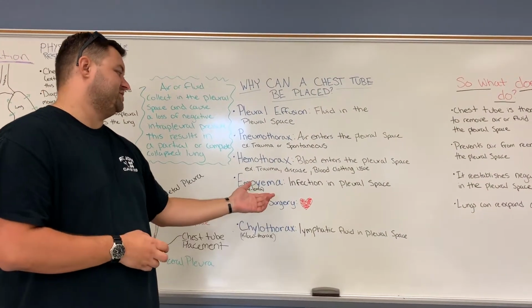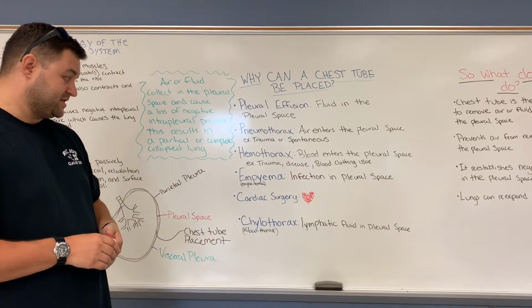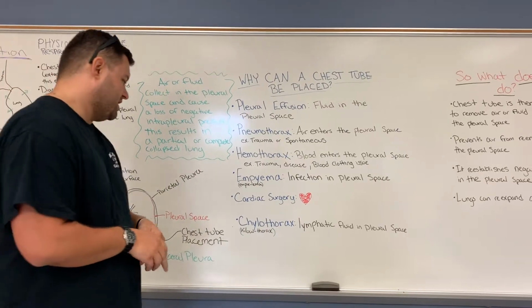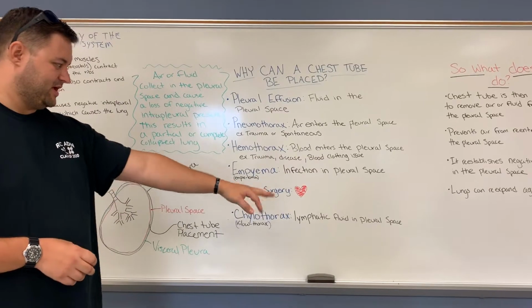Empyema, an infection in the pleural space. Cardiac surgery, which actually has its own type of chest tube. Or a chylothorax, which is lymphatic fluid in the pleural space.